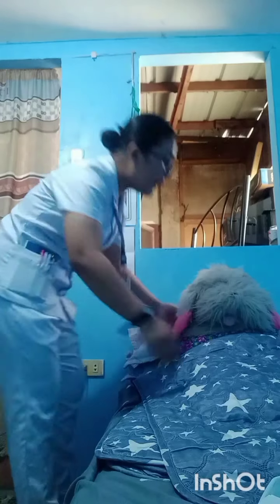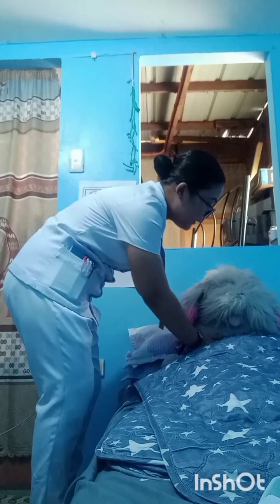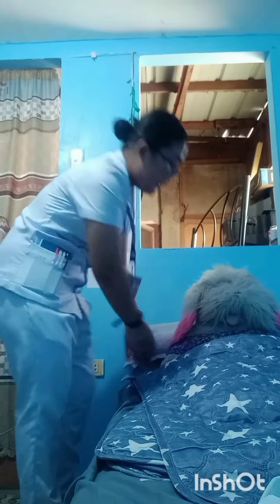Next, we're going to prepare our client as well as their supporting people or family. First, we're going to assist or position our client in a semi-Fowler or high Fowler position, because semi-Fowler or high Fowler position can promote lung expansion, which can help our client breathe easily. Ma'am, I'll position you like this so that you can breathe properly. Okay? Okay, thank you.